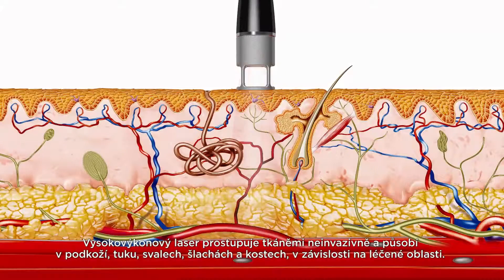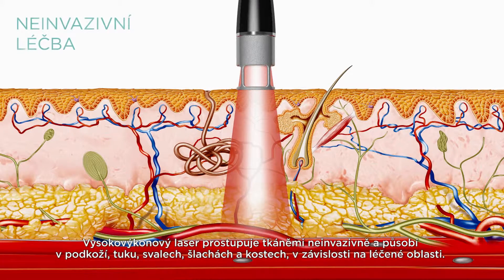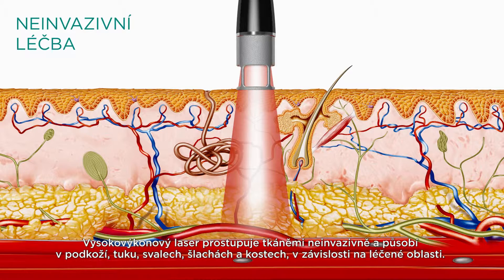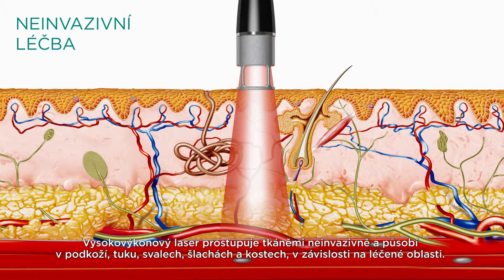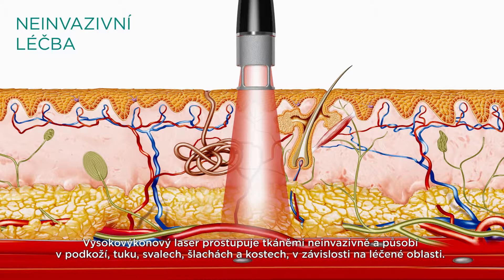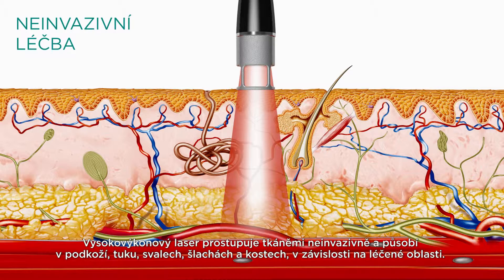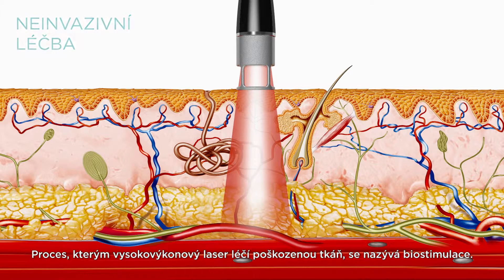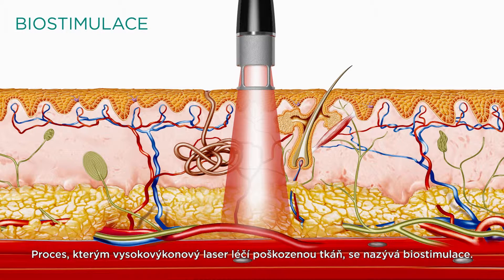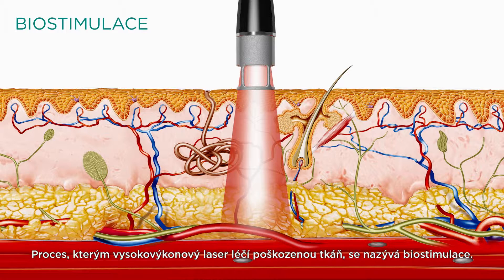High-intensity laser penetrates the skin non-invasively and spreads further into the subcutaneous fat, muscle, tendon and bone tissue depending on the location of the treated area. The process through which laser heals the damaged tissue is called photobiostimulation.